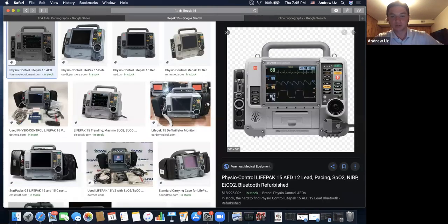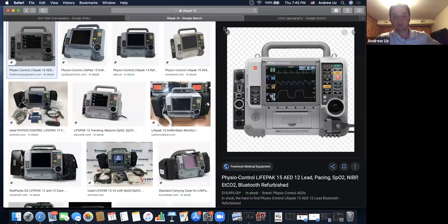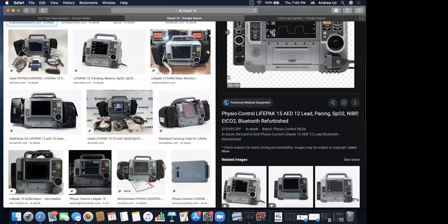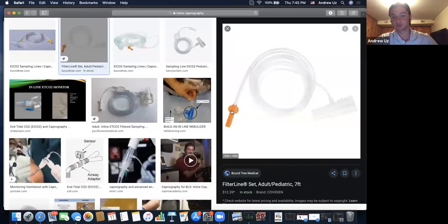Okay. So the LIFEPAK has this little flap up here at the very top, and it's even labeled CO2. You lift that up, there's a hole, and then this screws in, about a quarter turn. Very gentle. We've already had to replace one of these this year because somebody pushed. It's not a push, it is a screw. It's like a half turn, and it just goes into place.